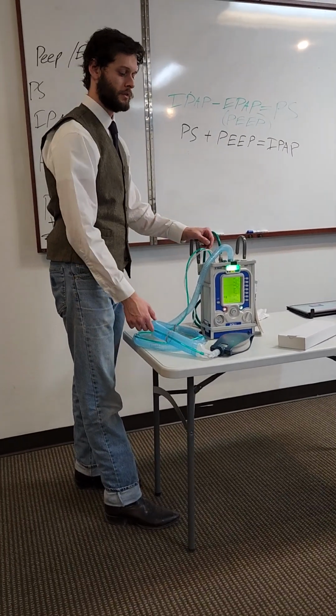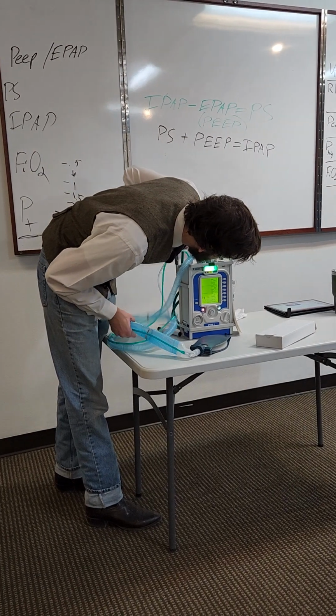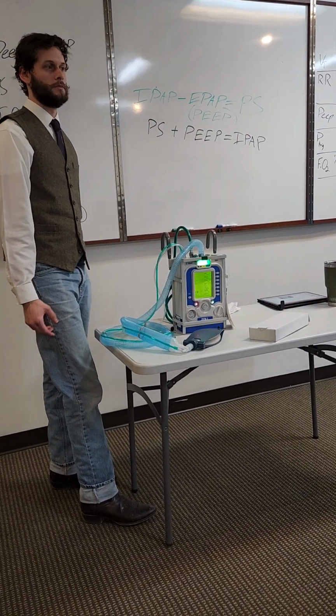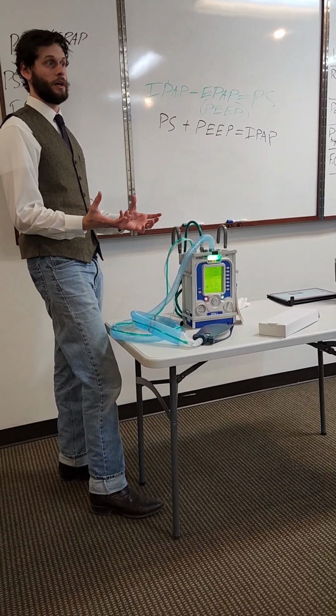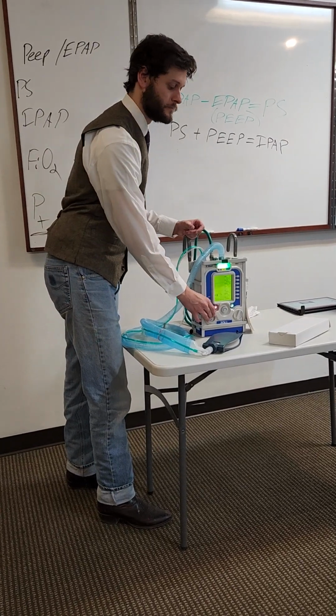Try it at 1. Because the other problem is, when you get to 0.5, sometimes if you shake it, it'll initiate a breath. So obviously we don't want it to do that. We don't want it to be so sensitive that driving the squat is going to initiate a breath. That would also be kind of uncomfortable.